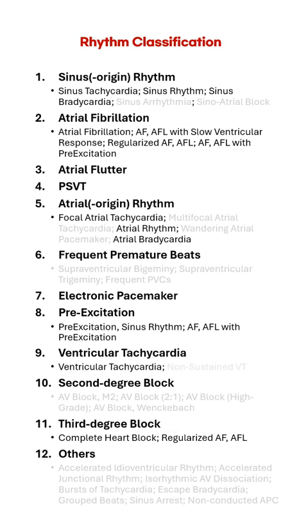Let's take a look at the rhythm classification feature of ECG Buddy. It can classify 11 basic rhythms. Additionally, by utilizing combinations of these rhythms and heart rate information, it can classify up to 19 detailed rhythms. The gray-marked detailed rhythms will be available after additional clinical trials, potentially allowing for up to 36 detailed rhythm classifications.